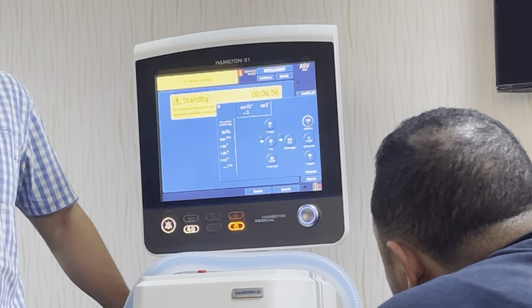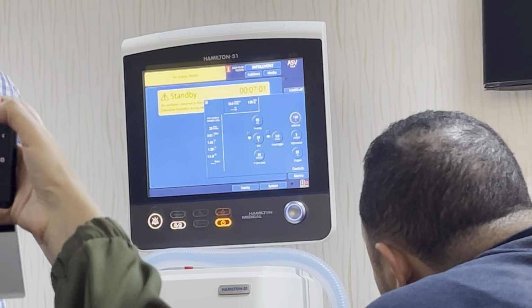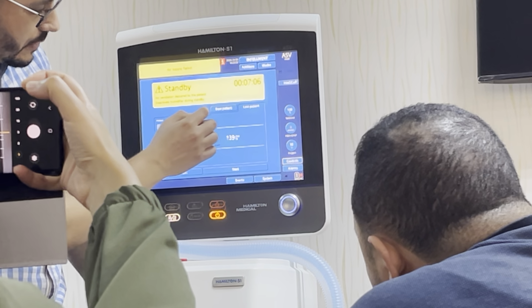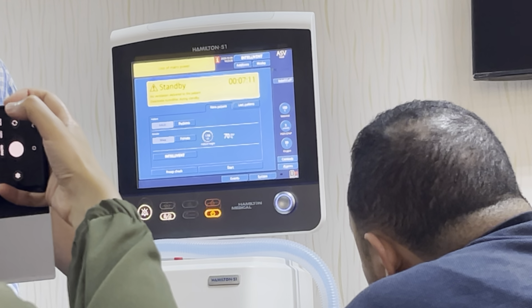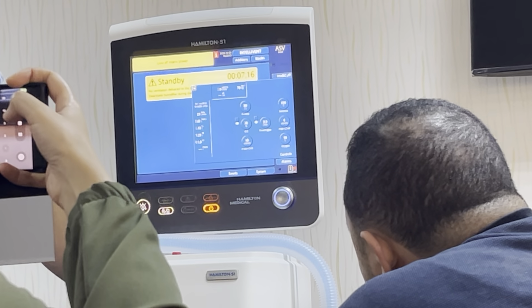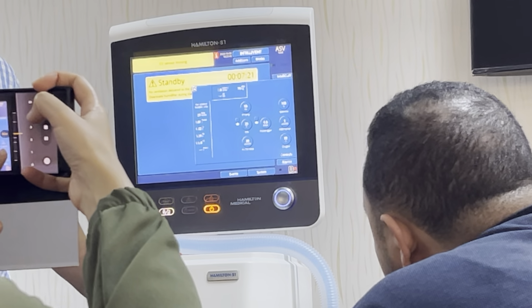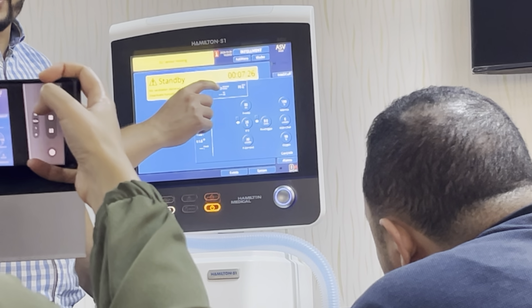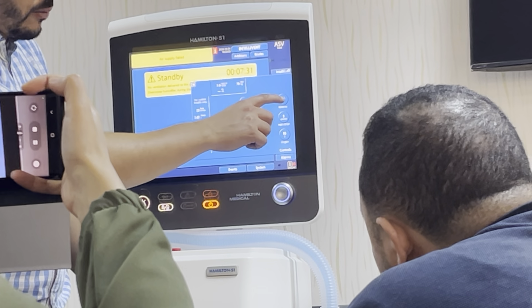So we have to decide how many liters of volume we have to provide per minute. In our case, the patient, let's say we have a patient of 70 kilo as a body weight, ideal body weight. The calculated minute volume for this patient is 7 liter. اللي حسبناها بكري. يعني 100 milliliter per kg per minute. If we multiply 100 by 70 kilo, we have 7,000 milli, which is 7 liter. So now we just select 100%.